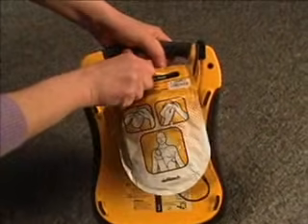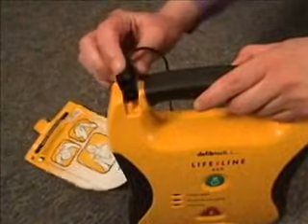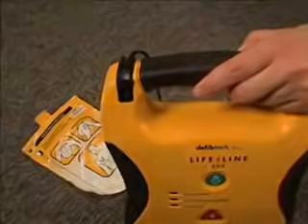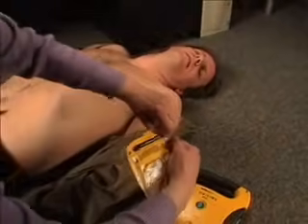Remove the pad package by pulling on the tab on the pouch. If the pads are not already pre-connected to the unit, connect them by inserting the pad connector into the top left corner of the AED. Remove the pads from the package by tearing along the dotted line, and follow the instructions printed on the package.